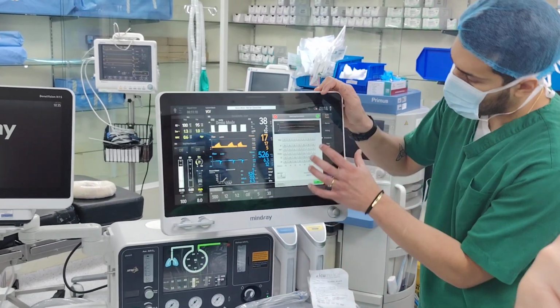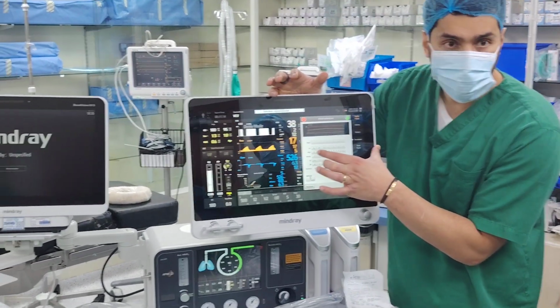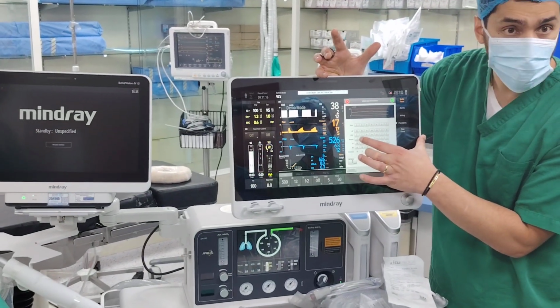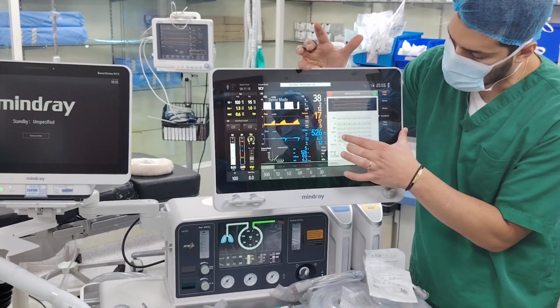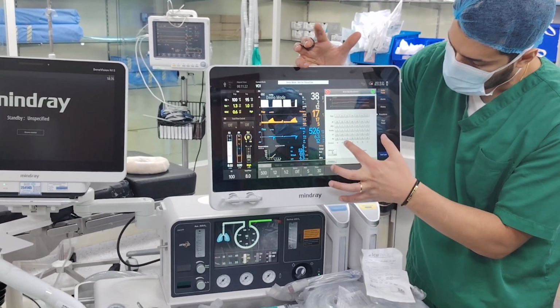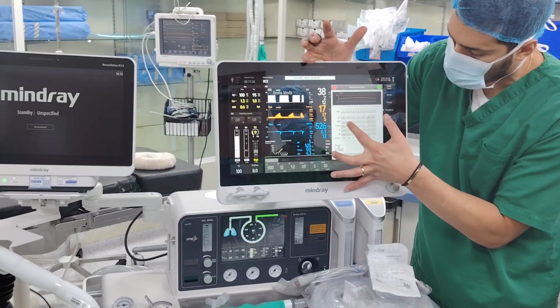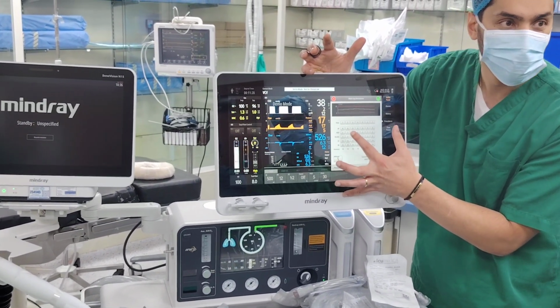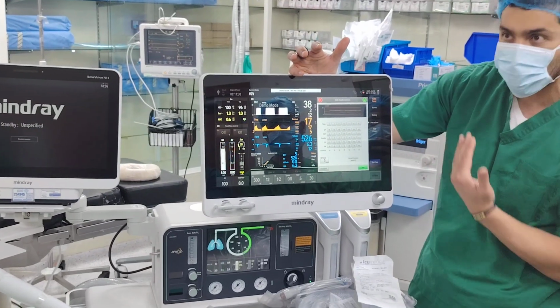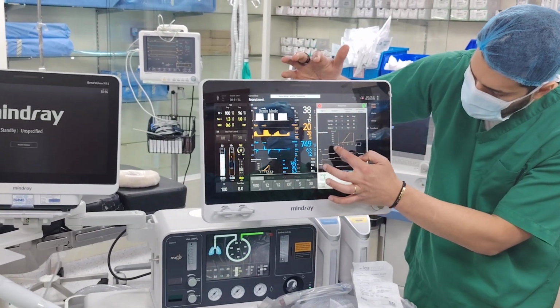So what happens right now? I give a pressure of 15 over PEEP of 5. How many times? 3 times. How long? You have the IE ratio and TI from these two. This total step, 15 seconds. After 15 seconds of 3 breaths, it will jump PEEP 5 to 7 alone. Then it will go up, up, up, then go down, down, down. How do you do it? Press start. Then you see it will do all this on its own.